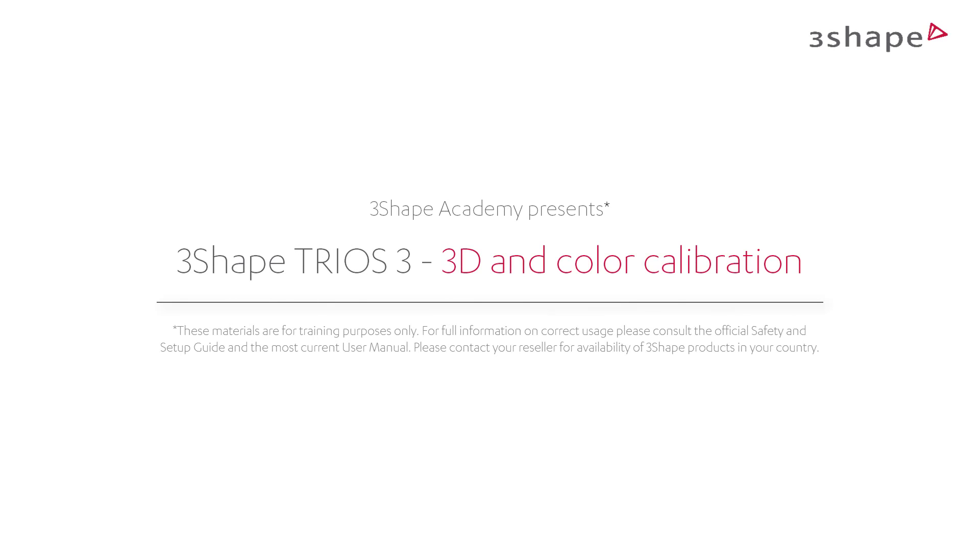In this video, we will go through steps of 3D and color calibration of the TRIOS scanner.